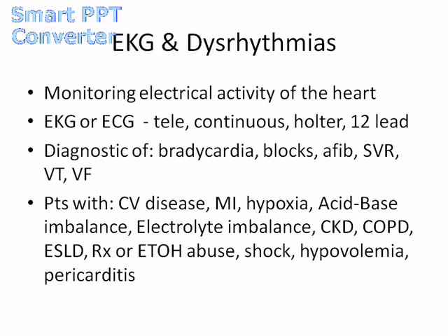So we use the electrocardiograph to record the electrical activity in the heart over time, and we get that reading through wires or leads by skin electrodes that are placed on the chest, and then in a 12 lead it's also on the limbs of the patient.